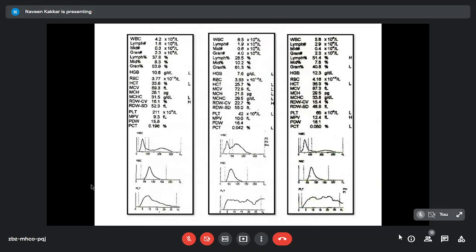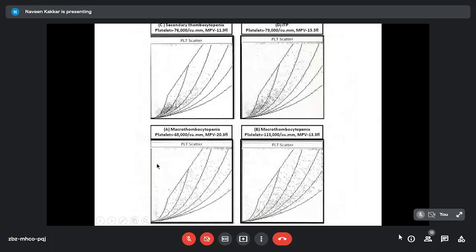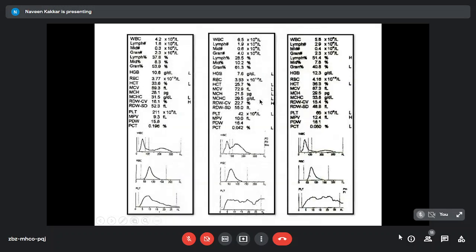Just taking you to 3-part analyzer printouts. That's normal. So you see the platelet histogram is going up, coming down into its own zone. But in these two patients with macrothrombocytopenia, two other patients, 42,000 count, 65,000 there, it rises but never falls. It goes into the red cell zone. Rises, continues in the high volume, and falls into the red cell zone. So what does this tell us? The histograms are speaking to us, and so are the 5-part platelet scatter plots, that there are many more giant platelets than normal. That's the giant platelet shown there.